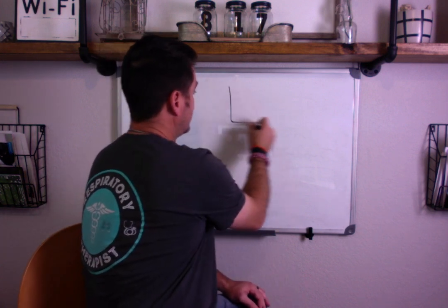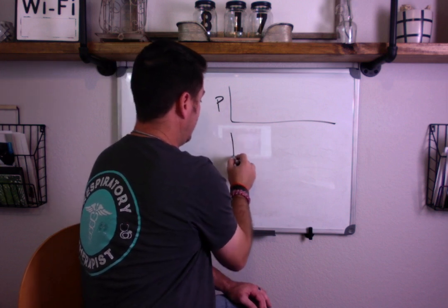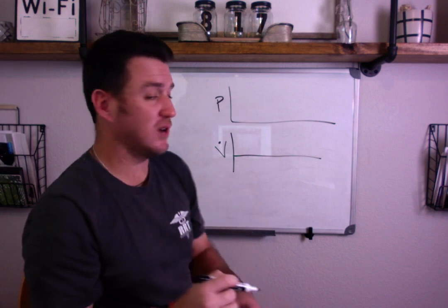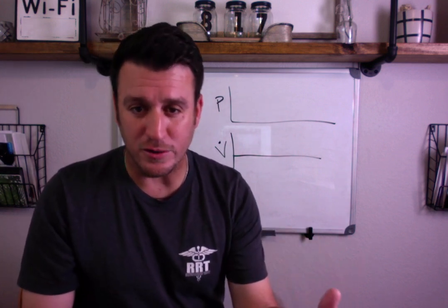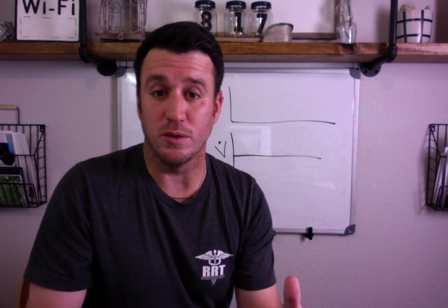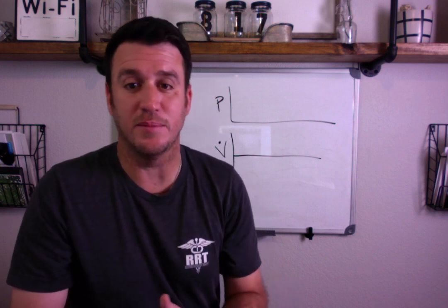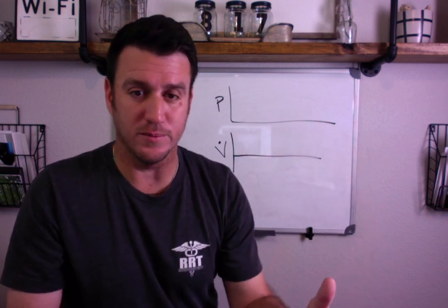So we've got our pressure, and we have our flow. Okay, those are our two waveforms. Volume comes into play also, but it's not a big indicator in your asynchrony world, okay? So when you're talking about asynchrony, you're usually talking about flow patterns or your pressure waveforms, okay?